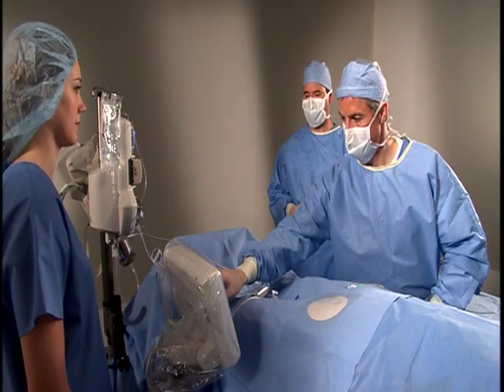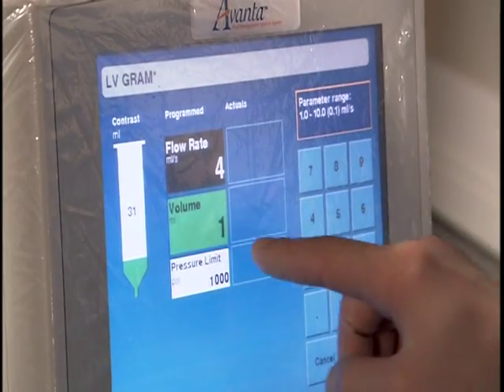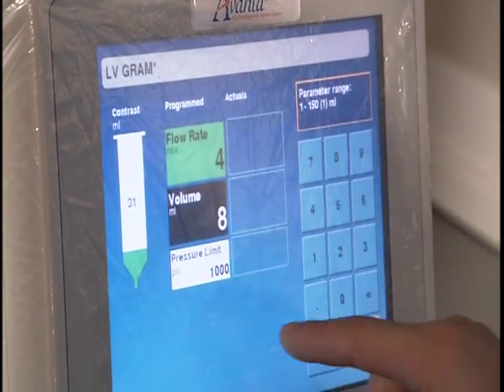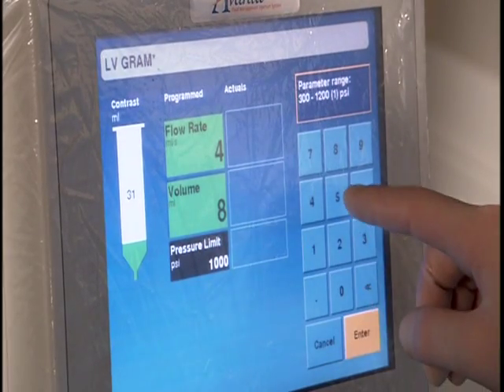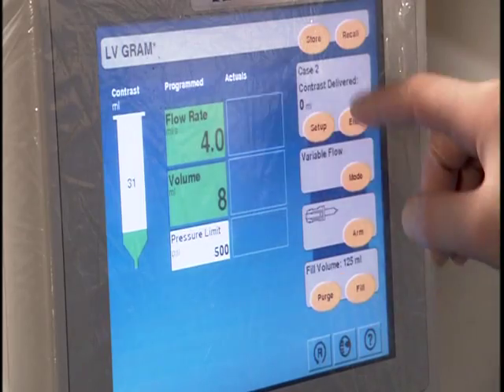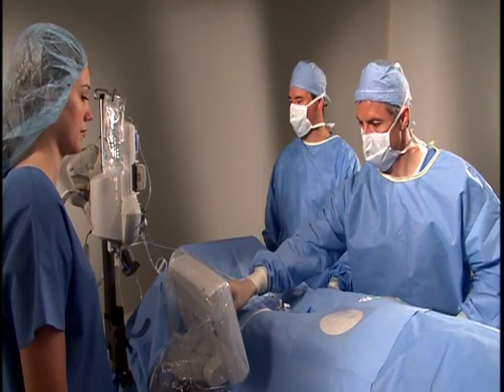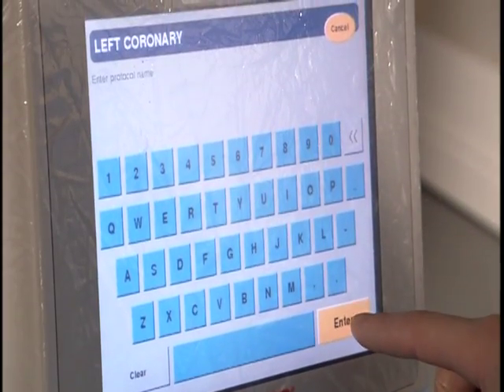The Avanta Fluid Management Injection System allows you to store up to 40 frequently used protocols. On the protocol screen, enter the parameters under the programmed column. Touch Store. Enter a title of up to 20 characters, including spaces, and touch Enter.